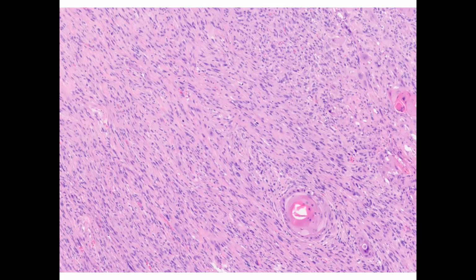Common things being common, really sample, look for that in situ component, do your stains, try your best, do a whole panel, add as many keratins as you need. And really work hard to prove that it is. But yes, it can be just keratin negative. But I think as long as you rule out other sarcomas and you rule out inflammatory myofibroblastic tumor, you're going to be pretty good with your diagnosis.